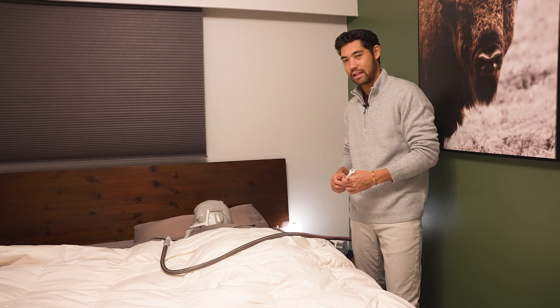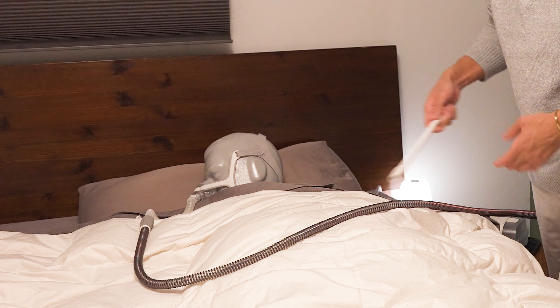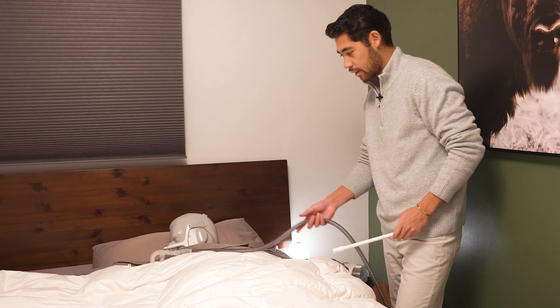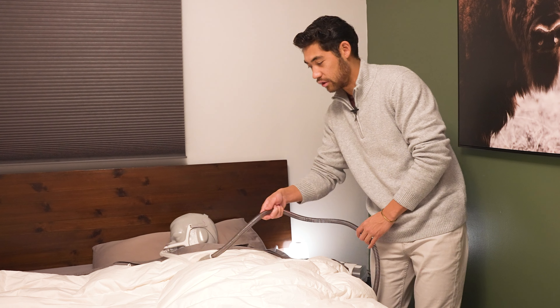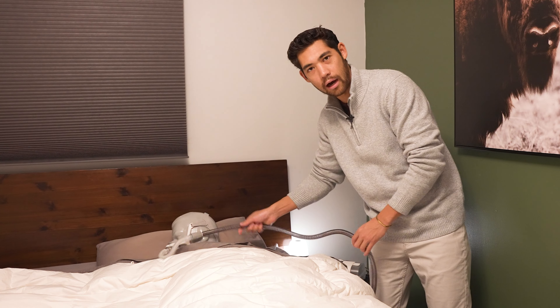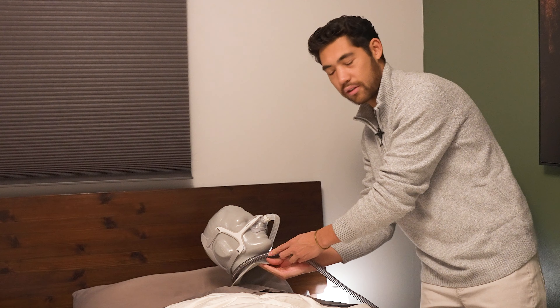How do we keep a CPAP tube from staying out of our face? We have Eric on the pillow here with an N20 mask connected to a heated line tube. Because he's facing that way and the machine is right here, the tube is kind of hitting him on the face. As he's sleeping, the tube is bothering him in the face, in the eyes, and maybe even in the ears. As he rolls over, he's almost in a noose — that's gonna contribute to more obstructive sleep apnea.